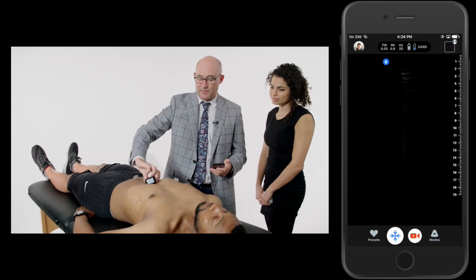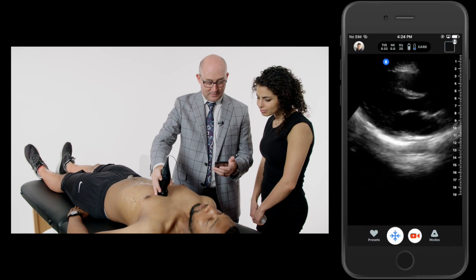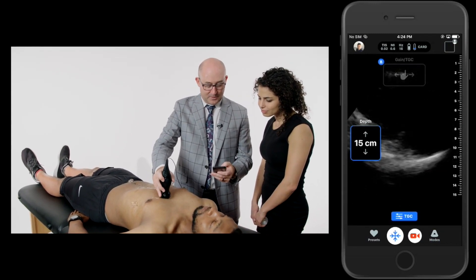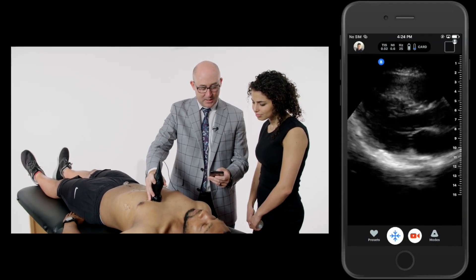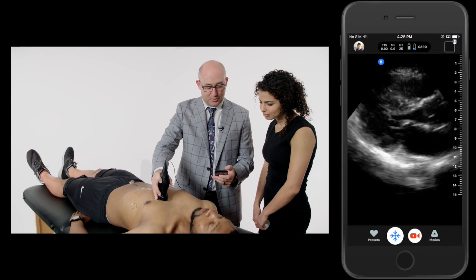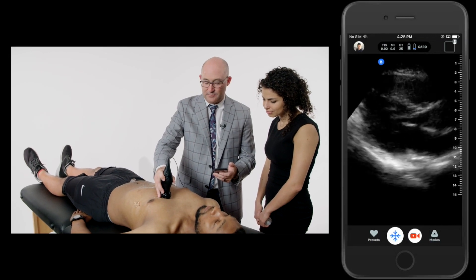Since I'm already in cardiac, I may as well come over and take a look at his parasternal long axis on his heart. I've got to change my depth — changing the depth is super easy, I just drag my finger down. I don't have to reach over to another machine or anything. Left atrium, left ventricle. I see the mitral valve smacking that septum. I see the aortic outflow tract there. RV, septum, posterior wall. Looks great. Good contractility.